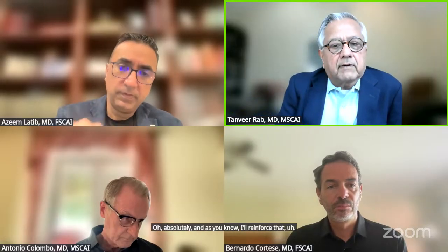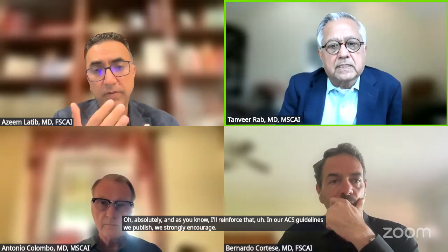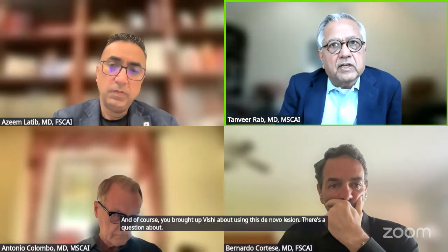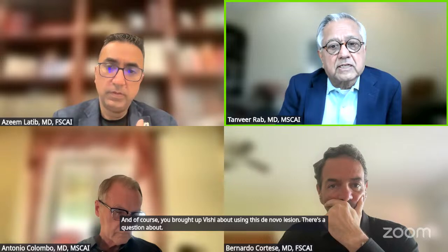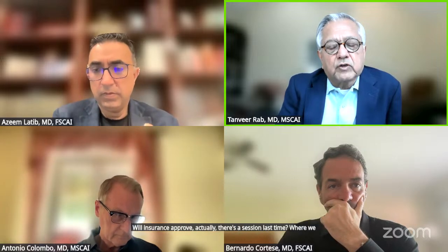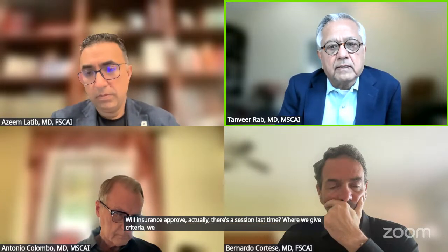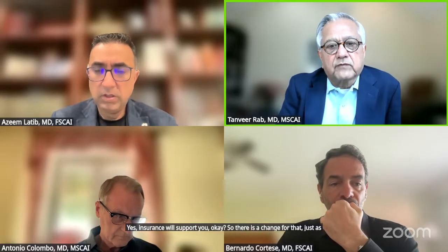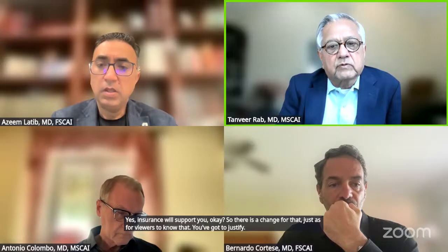And as you know, I'll reinforce that in the ACS guidelines we published, we strongly encourage imaging for complex lesions. So it's a type 1 indication in this country. And of course, you brought up the issue about using this in de novo lesions. There's a question about whether insurance will approve. Actually, there was a session last time where we gave criteria: if we justify it and document it well, as I did in this case for the reasons I showed you, yes, insurance will support you. So there is a change for that, just for our viewers to know. You've got to justify why you're doing this case, which was very justifiable.